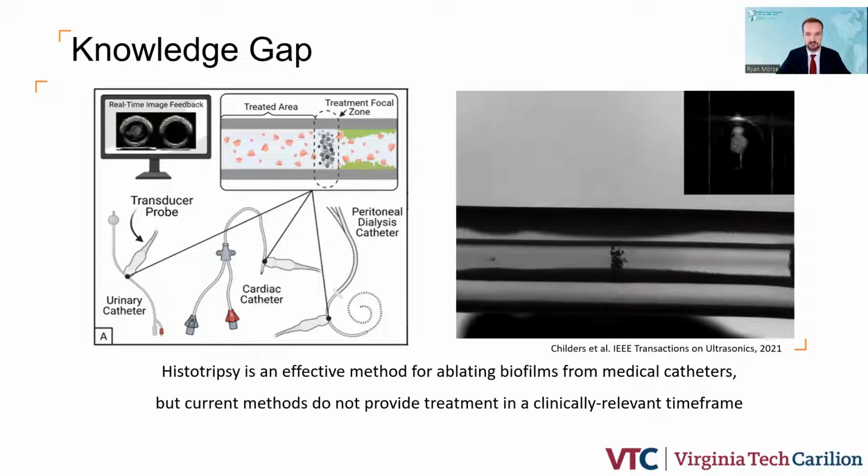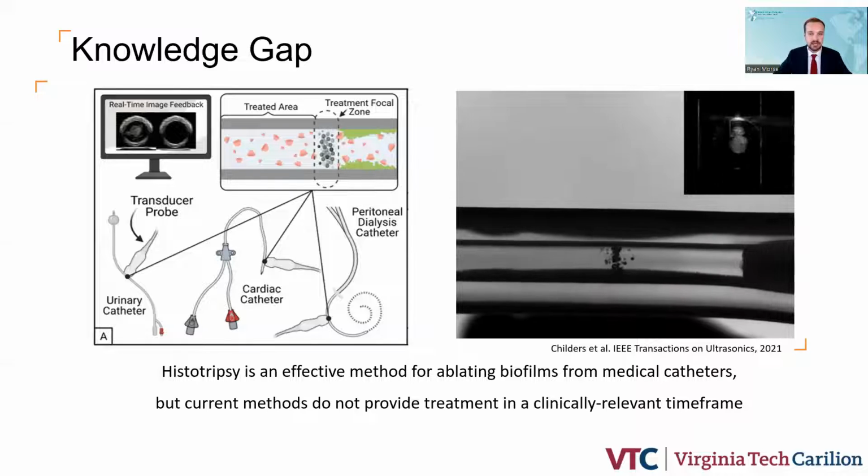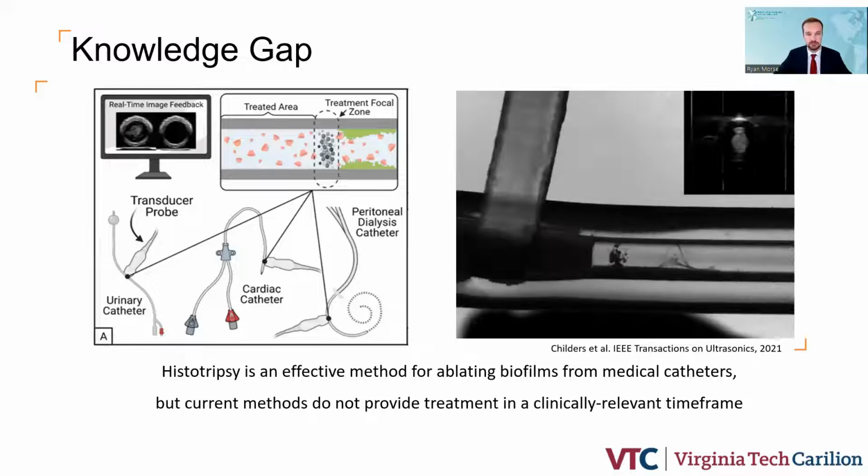The purpose of the present study was to develop new methods to improve the speed and efficacy of biofilm removal using histotripsy.